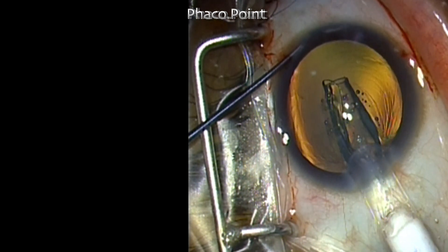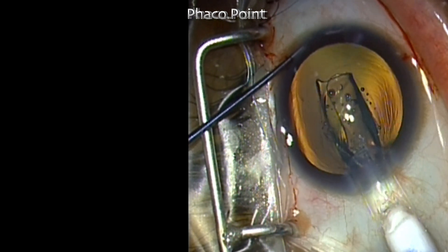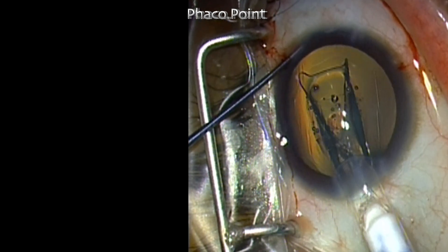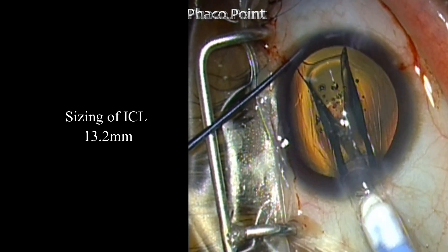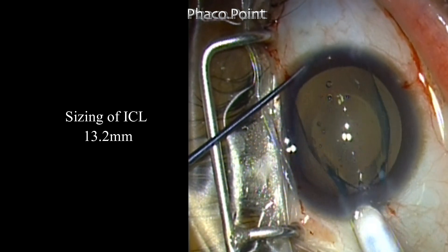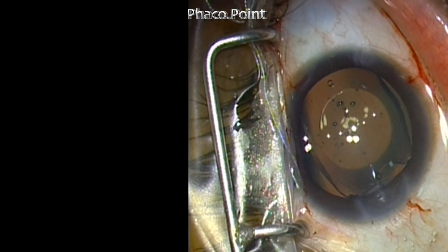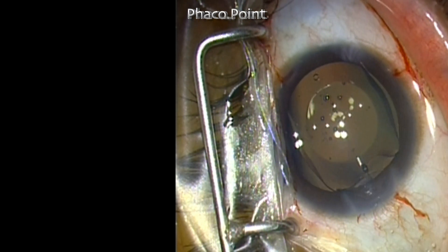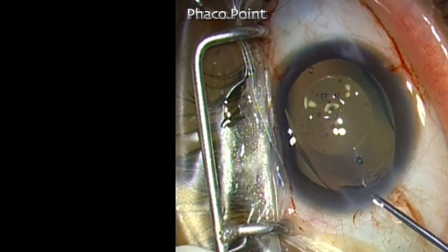As I inject the ICL inside the anterior chamber, I'm making sure that the perforation is lying to the right. This ICL has been sized at 13.2 millimeters by various methods of examination. The ICL slowly unfurls in the anterior chamber.